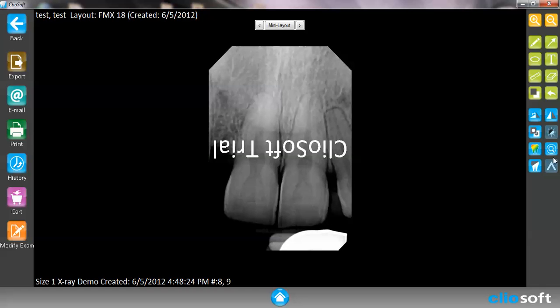We have the detail enhancer, which enhances the detail within the picture itself. Again we have the email, export, and all the other features that we have for intraoral images.